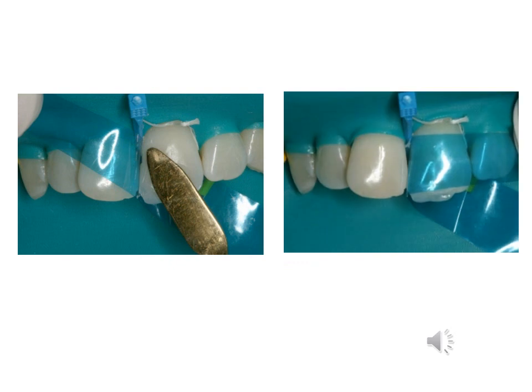Here, as you see in this picture, the application of the rubber dam, retraction cord, celluloid strip, and the application of the composite restoration inside the prepared tooth and contouring of the filling material and good adaptation to the surface of the tooth structure by the special type of composite resin material.